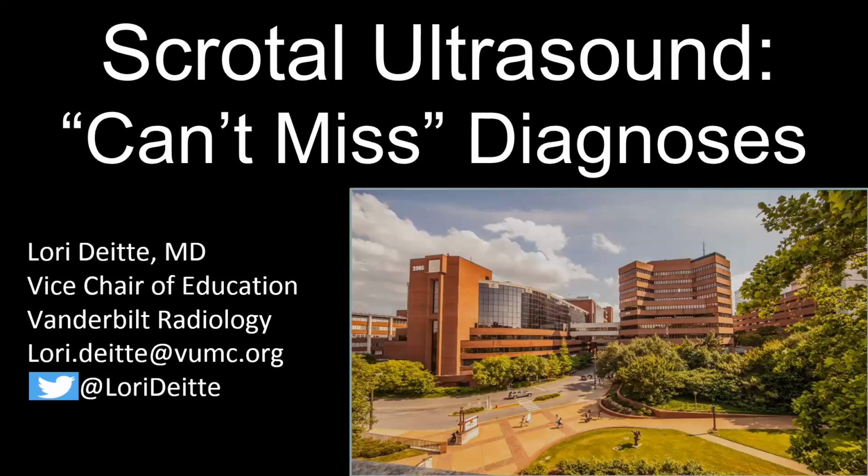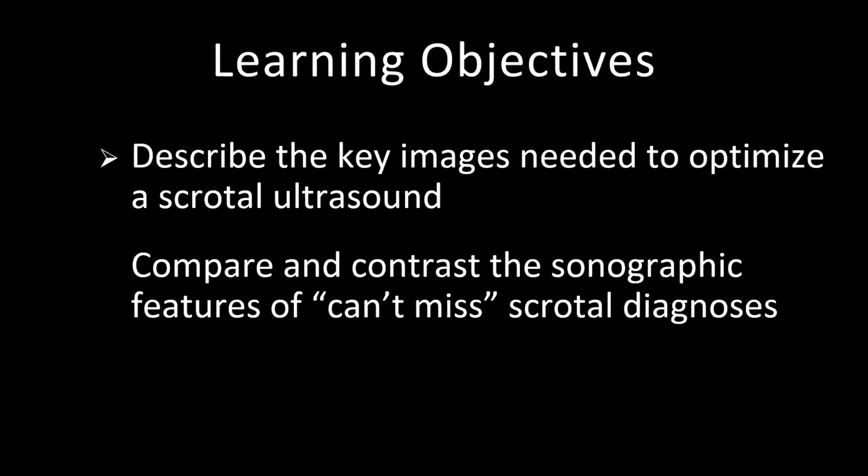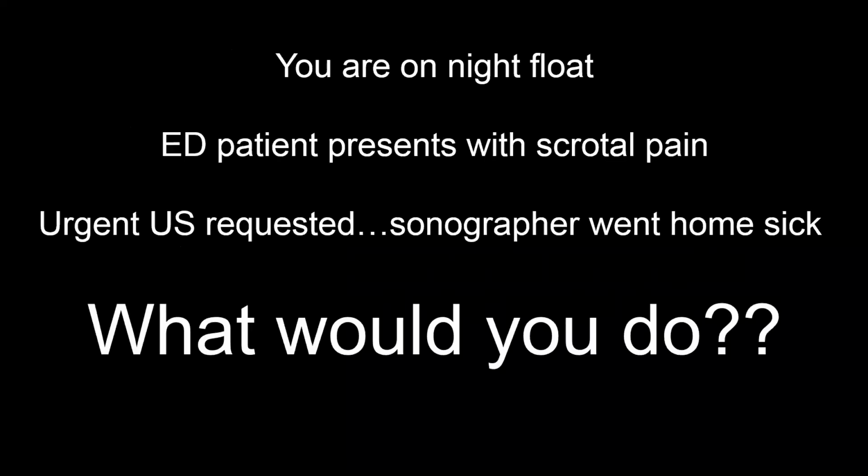Welcome. My name is Lori Deitte, and we're going to be talking about scrotal ultrasound can't miss diagnoses. I don't have any disclosures, and I have two learning objectives. The first one is to describe the key images needed to optimize a scrotal ultrasound. And secondly, to compare and contrast the sonographic features of can't miss scrotal diagnoses.